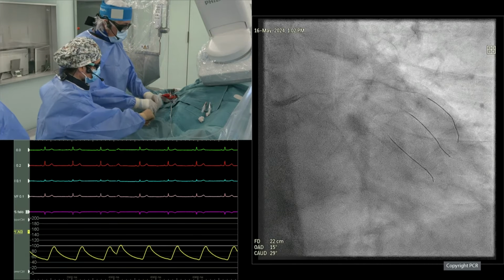So now the plan is, I think it's important now to do OCT, and then we decide what to do next. Yeah, exactly. And so another safety maneuver we are going to do, Emanuele, is to perform a dilation with a 3.0 balloon. Which was the balloon you used? Which was the size? It was a 3.0, the one that you gave me? Yes. Okay. But we already pre-dilated with a 3.0. Yeah.